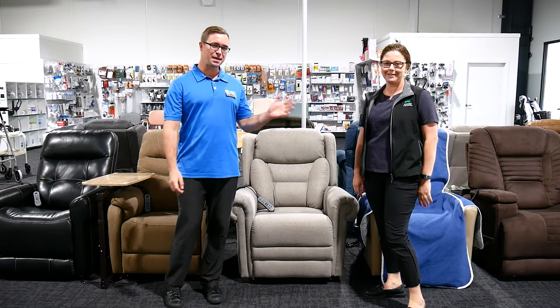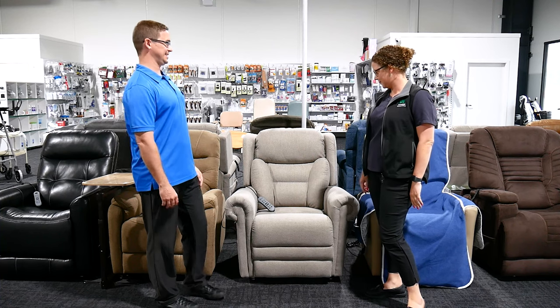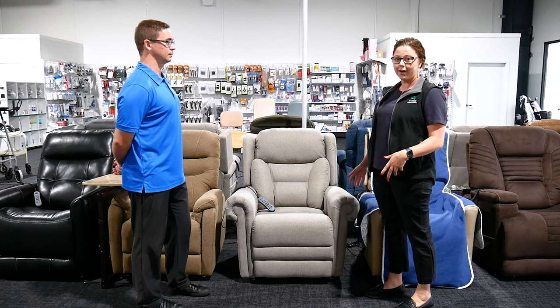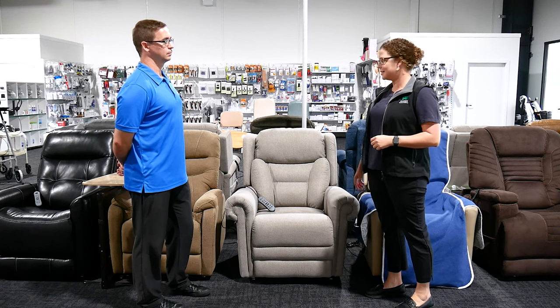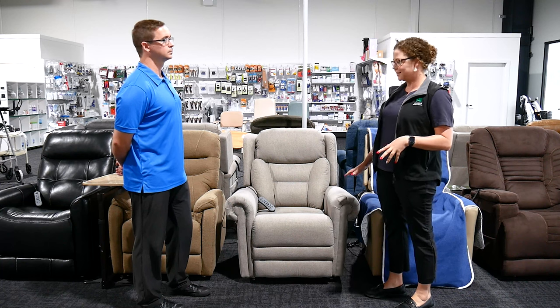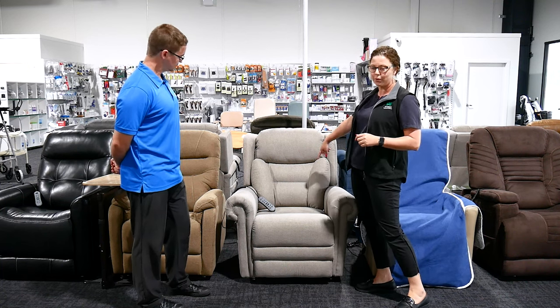We're at Anstey's today with Bec and we've got a recliner in front of us. This is our Donatello lift chair. It's an Aleveo range which is exclusive with Anstey's. It's a little bit different to most of the other recliners that we generally stock because it does have these lateral back supports.